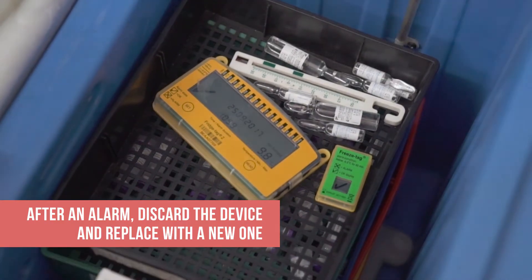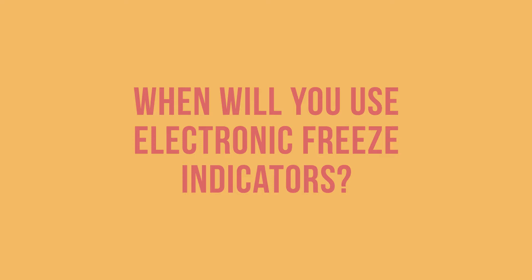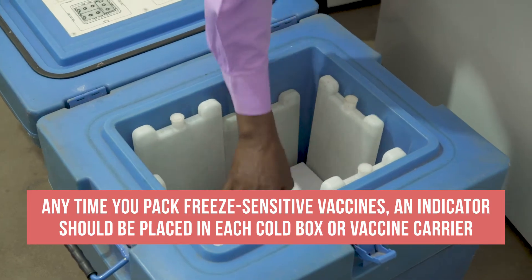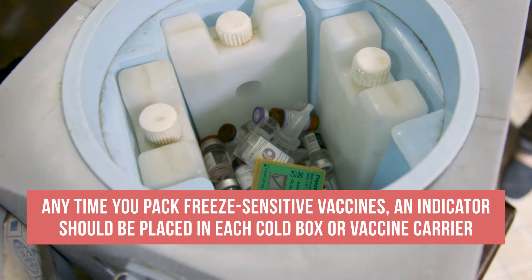It should be discarded and replaced immediately with a new one. Any time you pack freeze-sensitive vaccines, an electronic freeze indicator should be placed in each cold box or vaccine carrier.